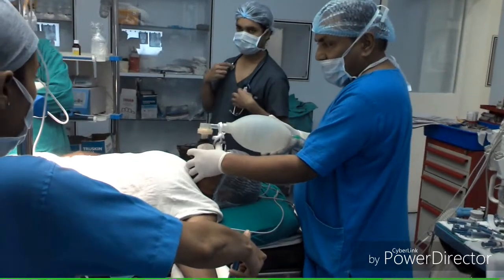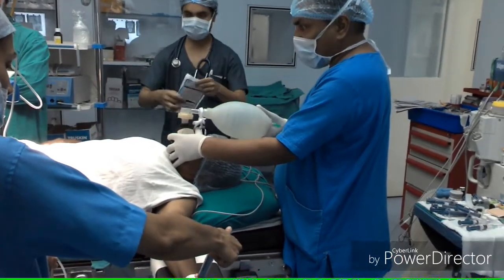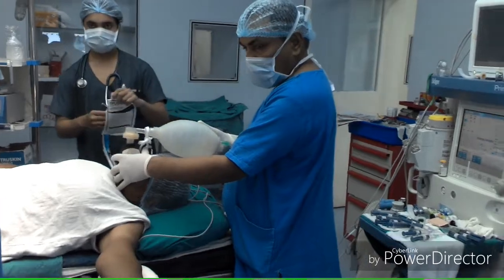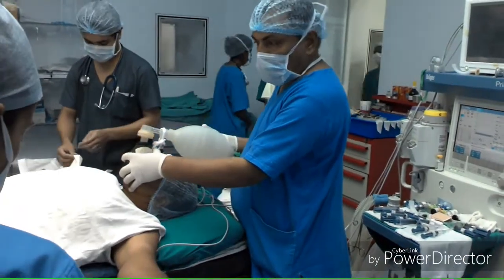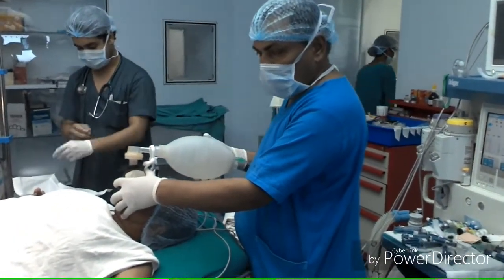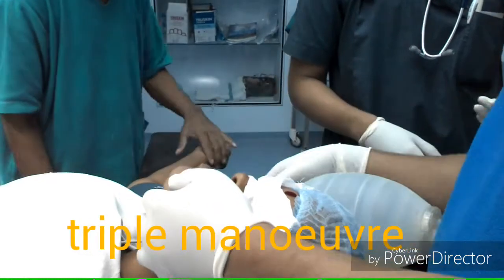It's mainly used for resuscitation outside hospital to give positive pressure ventilation to a patient who is not breathing or inadequately breathing. It's used in critical care unit, operation theater when the anesthesia machine is not working during surgery due to some mechanical or electronic fault, and during transport of patients who are ventilator dependent.